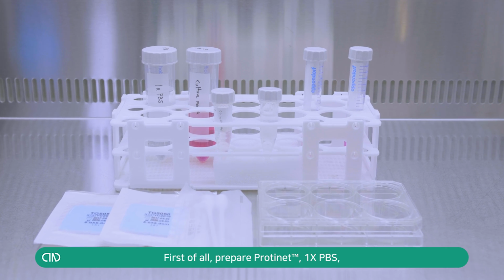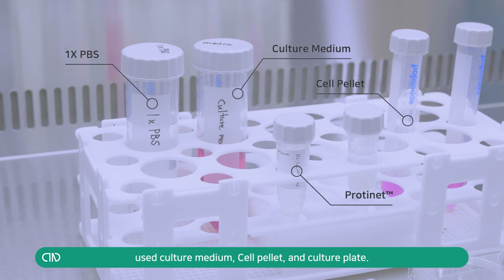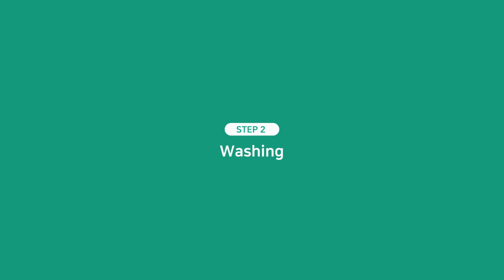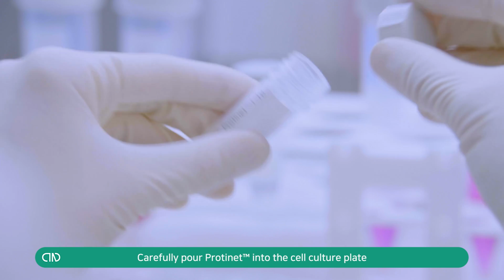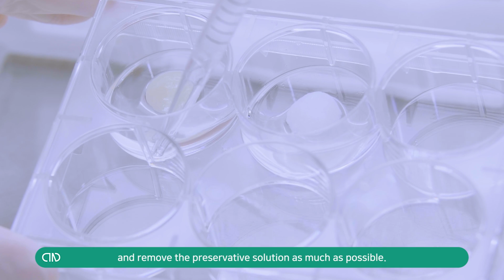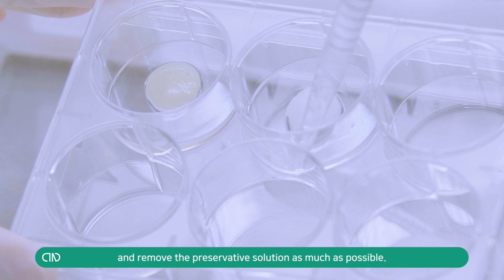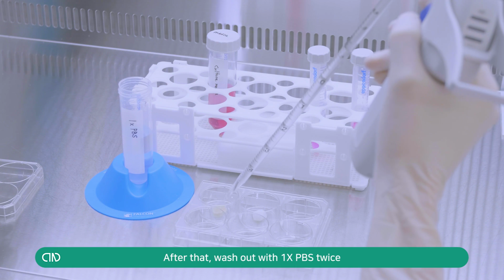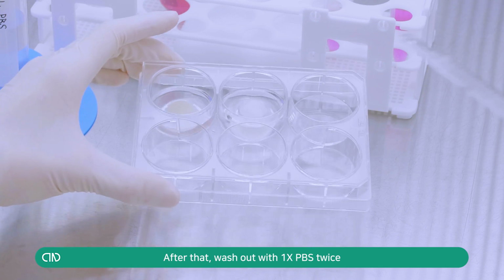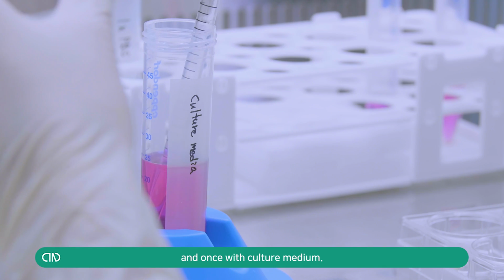First of all, prepare Protinet, 1x PBS, used culture medium, cell pellet, and culture plate. Carefully pour Protinet into the cell culture plate and remove the preservation solution as much as possible. After that, wash out with 1x PBS twice, and once with culture medium.